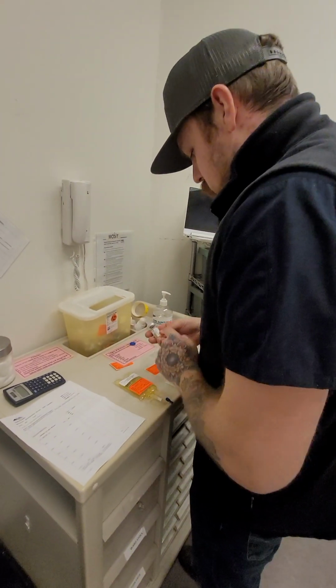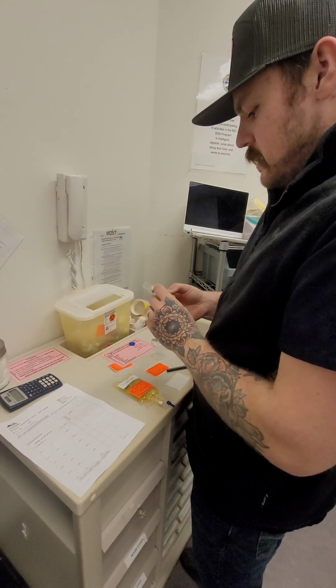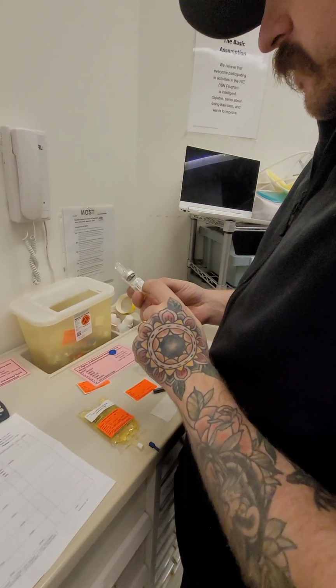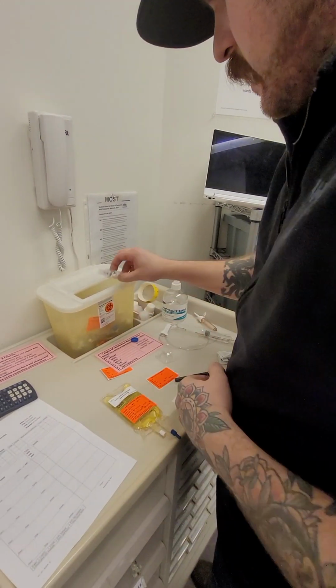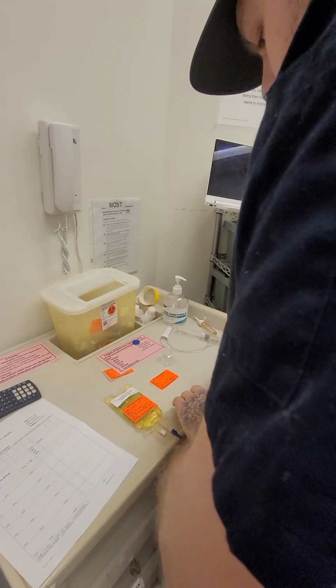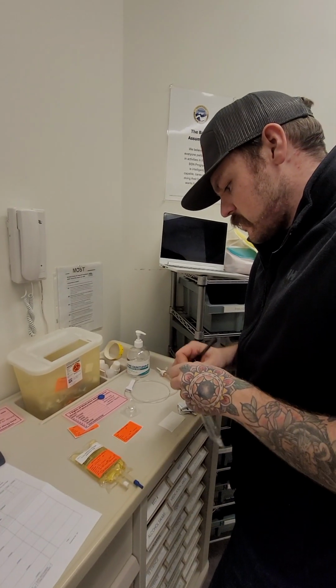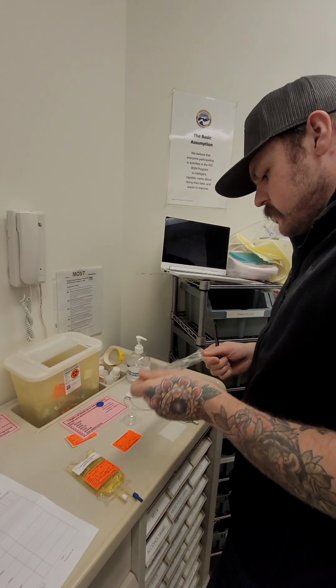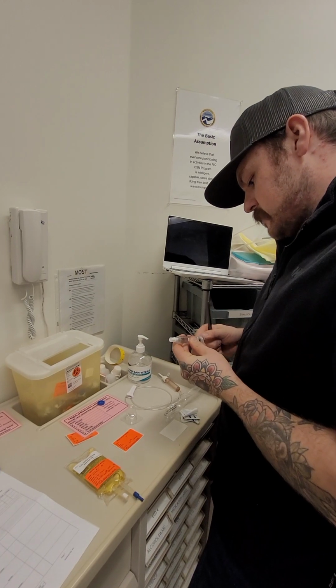So now that I've made sure that we got cefazolin, I can do my last check, which is returning the medication or discarding the packaging. So cefazolin, 1 gram, 1 gram, not expired. Okay, so I can go ahead and dispose of that. So we're going to have to ensure patency. So what I'm going to do is I'm just going to get this out of the bag here. This is sodium chloride. It's not expired.